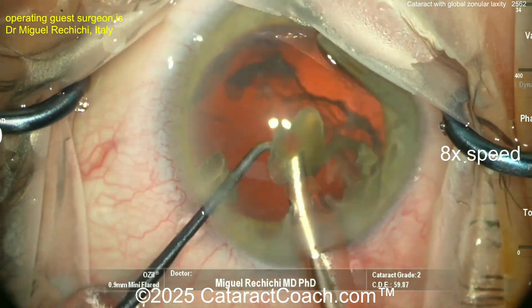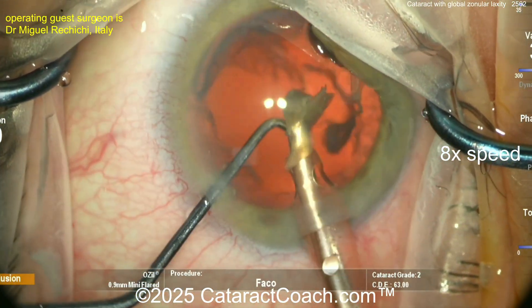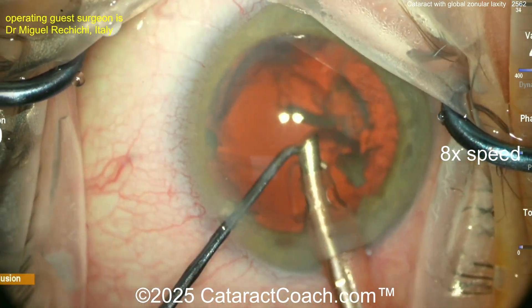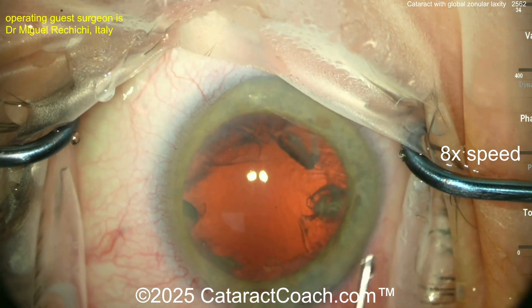Protect that capsule bag — it could flop around a little bit. Let's slow down the video in just a minute after we get all these pieces out. Nicely done there — not too much cortex left behind. Viscoelastic here is a smart move to keep the bag away.